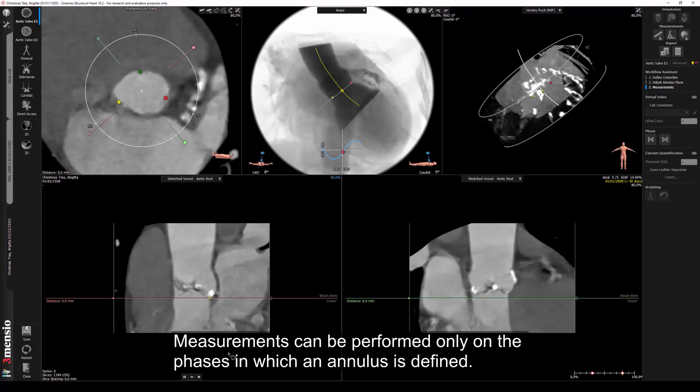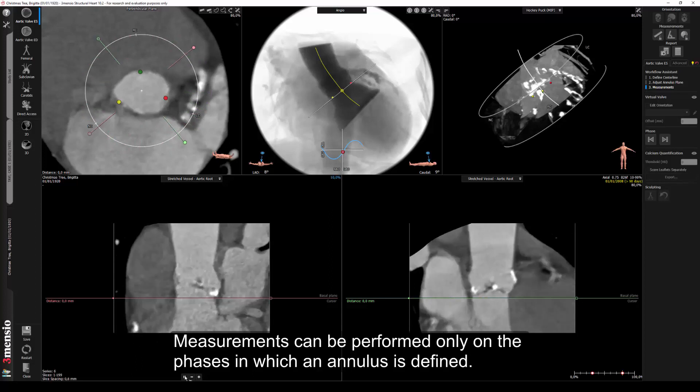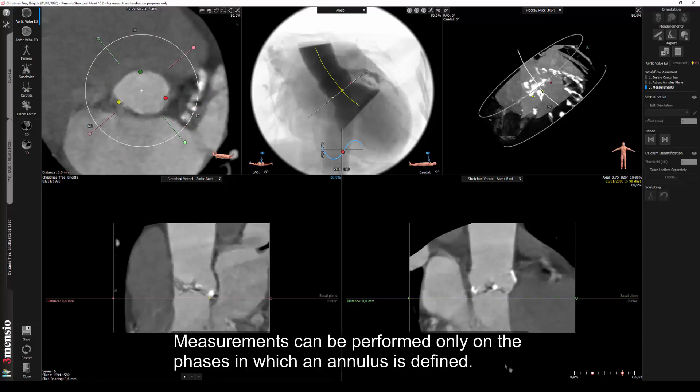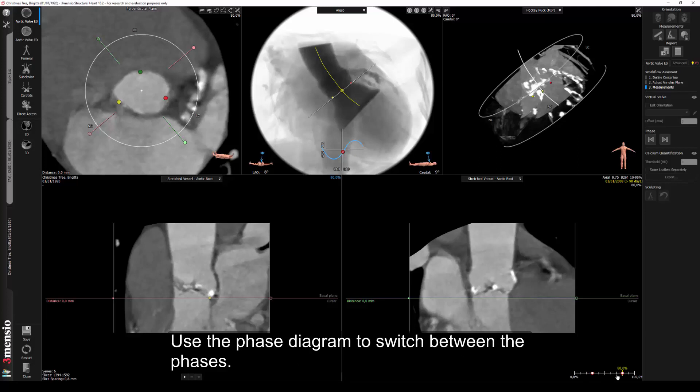Measurements can be performed only on the phases in which an annulus is defined. Use the phase diagram to switch between the phases.